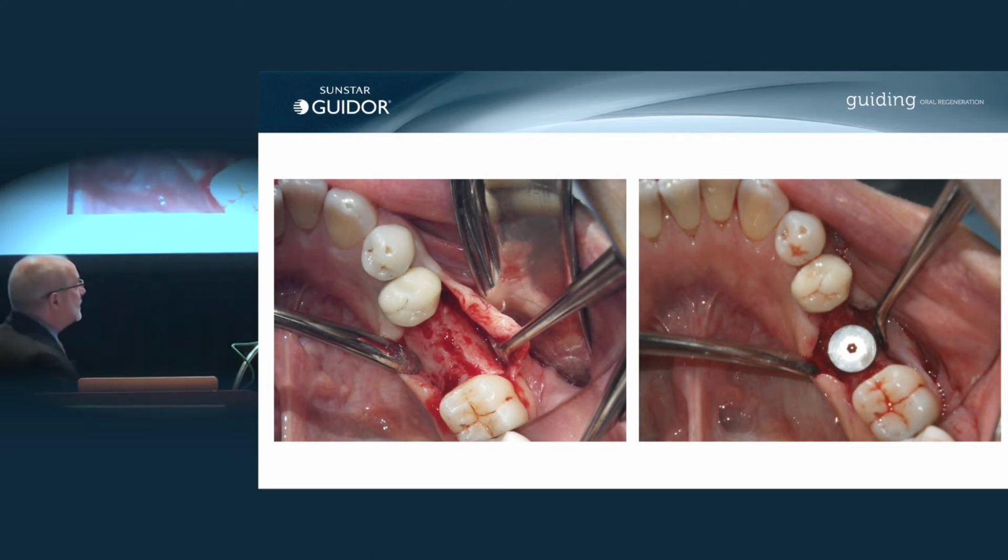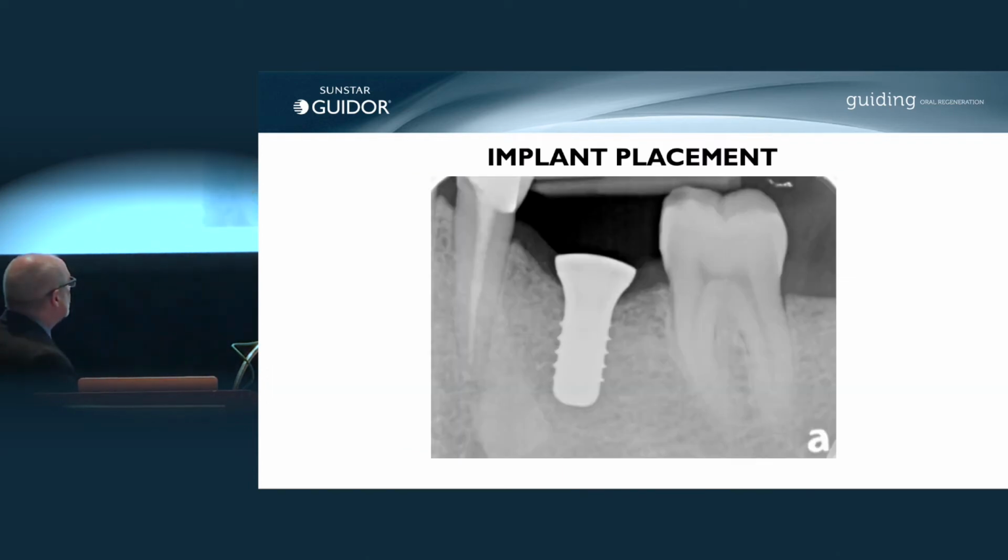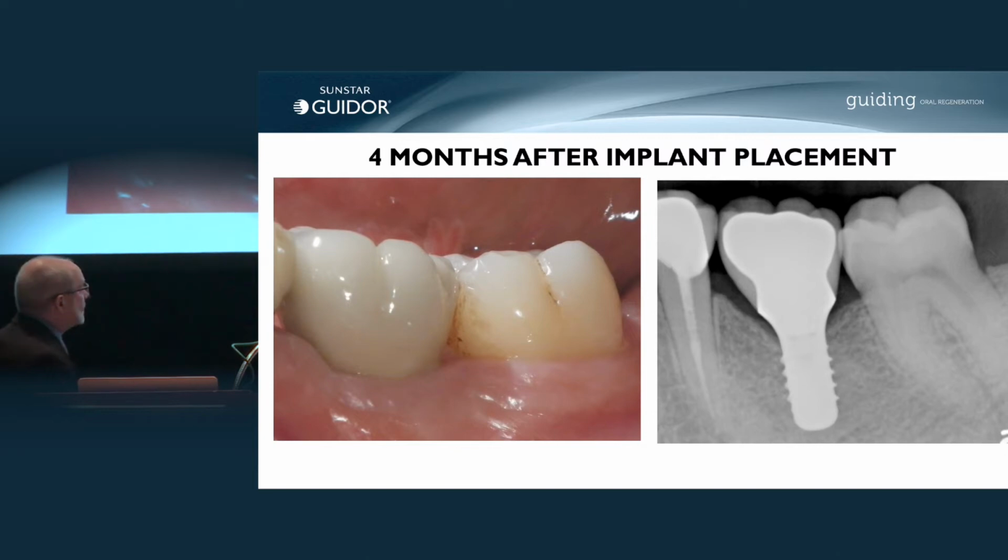So the implant is placed. So there's the implant placement. And 4 months after implant placement, it was when the implant was restored.